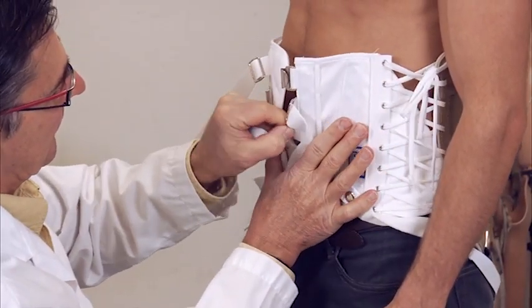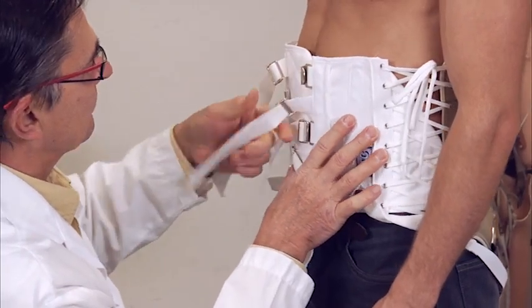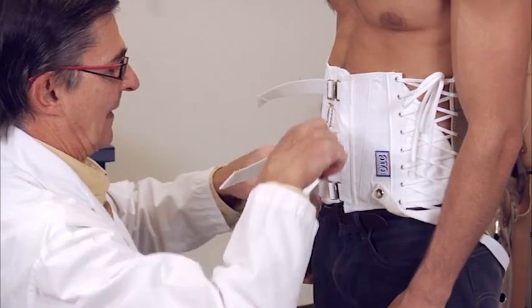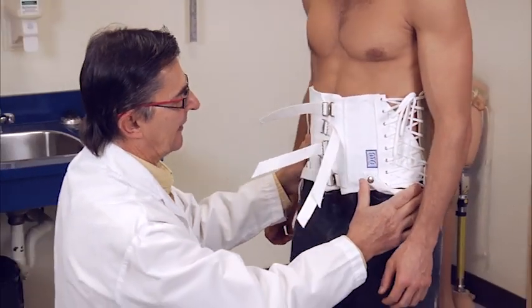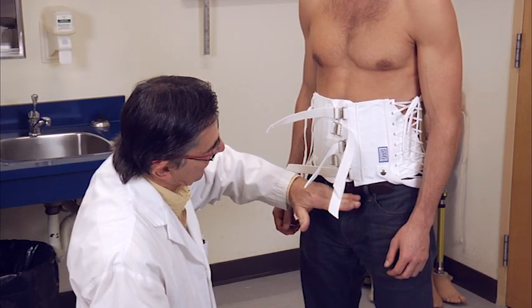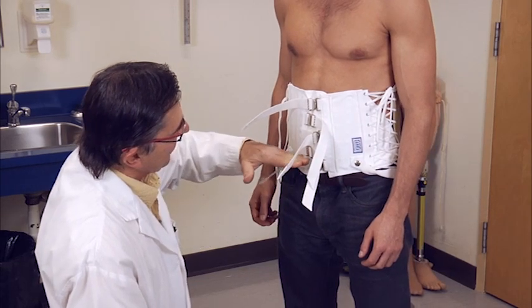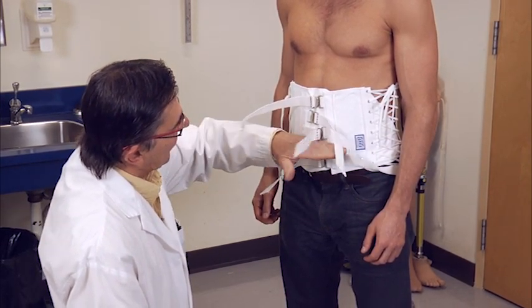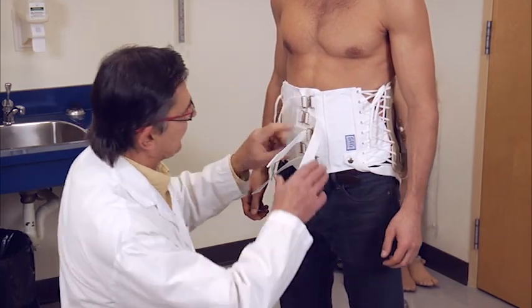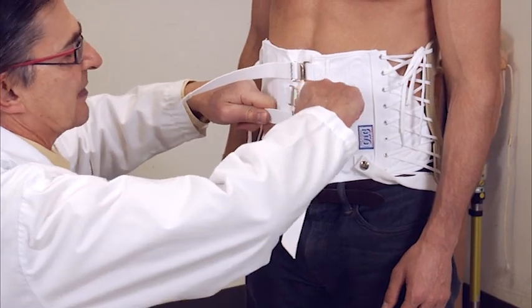Now I'm just going to explain the straps. Looking at the brace as it should be applied, the key with applying the bib is we want to keep the bottom of this bib as low on the abdomen as we possibly can. That's because we want to draw the tummy up with the bottom of this. Don't fall into the mistake of applying the bottom of the brace at the level of the navel — otherwise it's going to ride up too high. You'll notice that these buckles go in opposite directions so that the patient can use the straps against themselves to tighten them up.